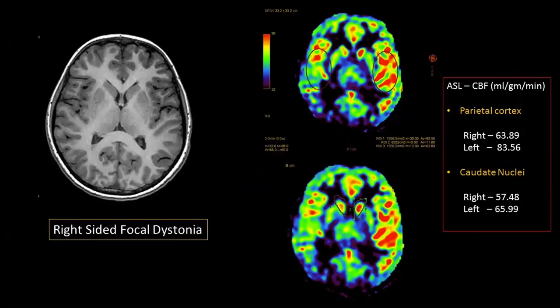Another example: a 14-year-old presenting with features of right-sided focal dystonia, where ASL showed relative hyperperfusion on the left. This has been described due to recurrent dystonic episodes — the recurrent activity is visible on ASL as hyperperfusion, which is an effect rather than a cause of this particular condition.